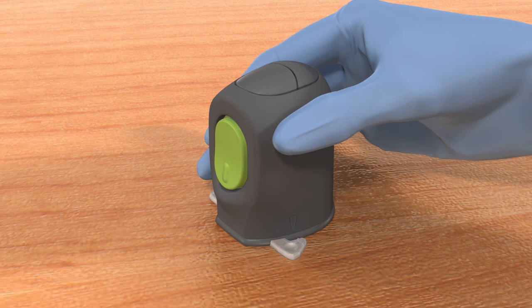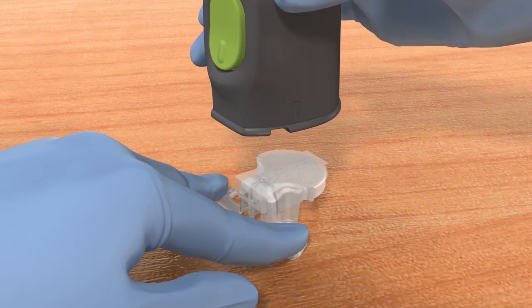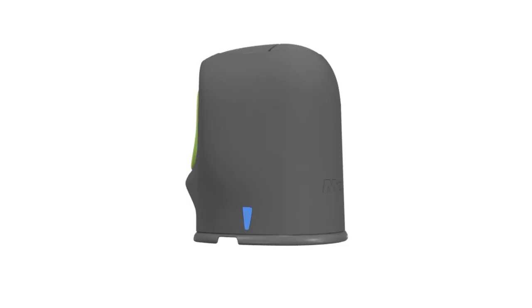Hold the pedestal arms with two fingers. With your other hand, pull the Sertor straight up. Do not detach the pedestal in mid-air or you might damage the sensor. The sensor remains inside the Sertor. The arrow on the side of the Sertor shows where the sensor is located.